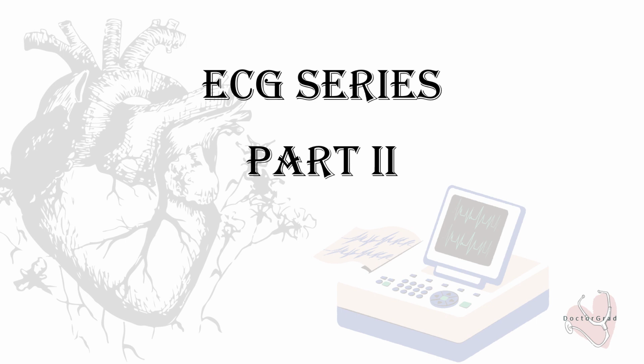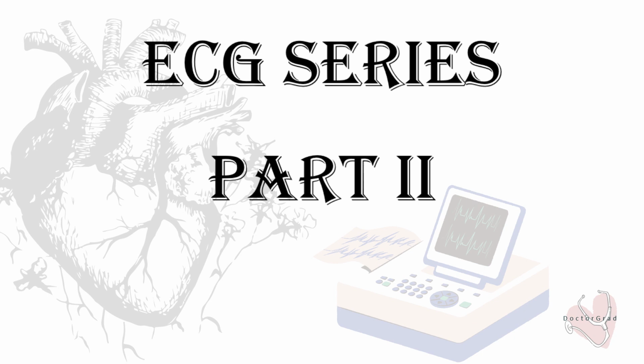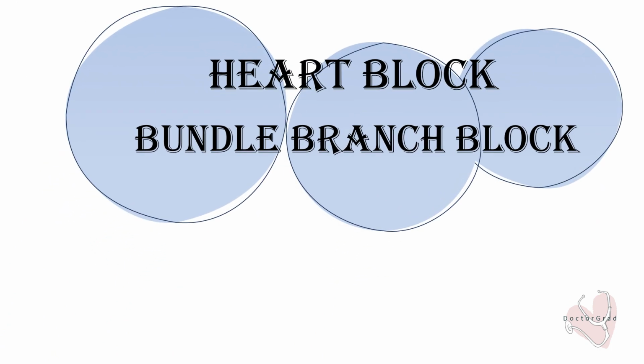This is the second chapter of our ECG series. In this chapter, we are discussing heart block and various bundle branch blocks. We're seeing what the ECG looks like in heart block, what the different types of heart block are, and we'll see what we expect in right bundle branch block, left bundle branch block, and something known as the bifascicular block and the left anterior fascicular block. All of that we'll see in detail.